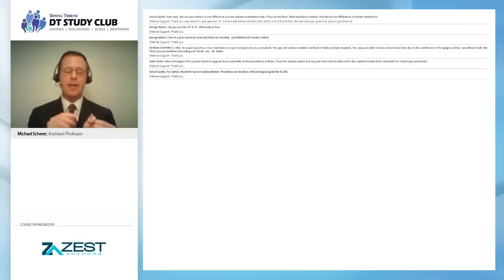And the neatest part is that you can take this PVS that's inside of the denture. Hopefully your radiology technician or your dental assistant doesn't say, "Oh, let me help you out, doc," and strip this out. No, don't do that. It's happened to me a couple of times. What you can do is pour a snapstone cast inside of that green mousse and create a solid working model to work off of, because Anatomage does require a solid cast or an optical STL file of that solid cast.